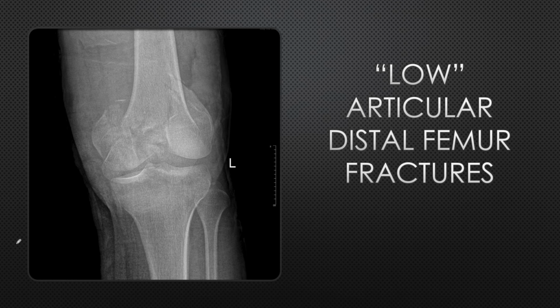So this was a 21-year-old male who had sustained injuries because of a road traffic accident, and there was direct impact on the knee in flexed position, and there was an open wound of 1 centimeter size without any other issues. So we went for x-rays. This was the first AP view we got done, and this was the lateral view.